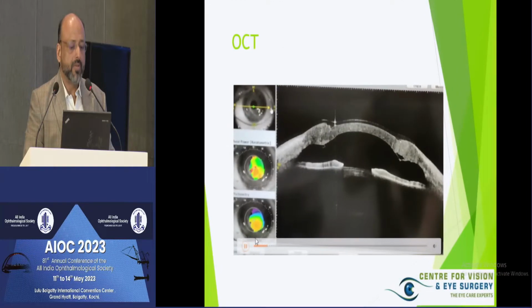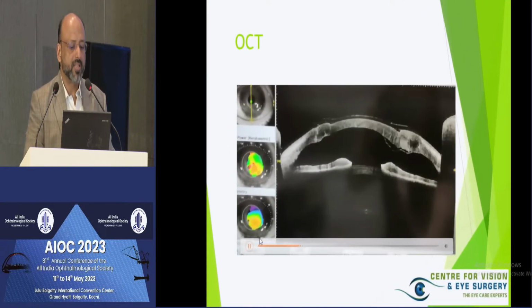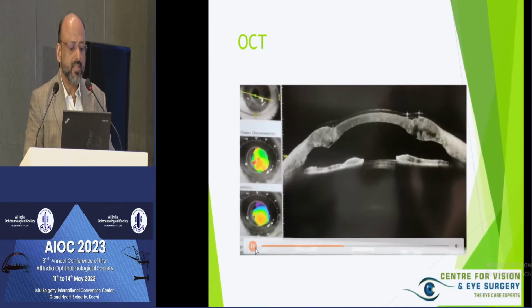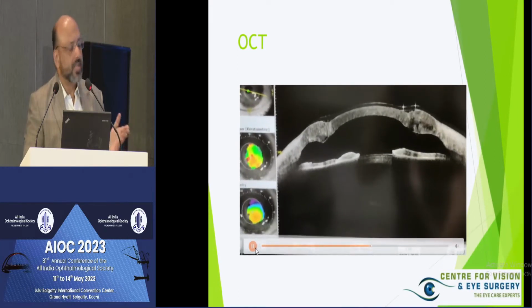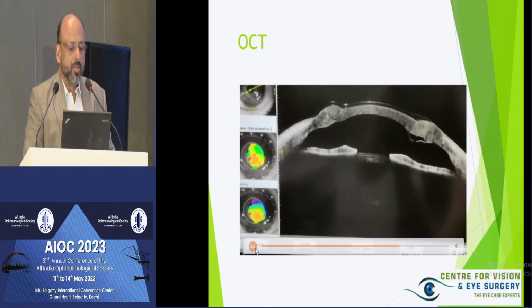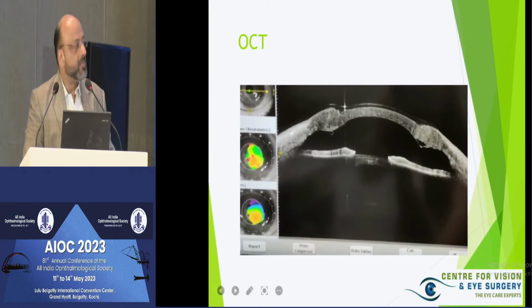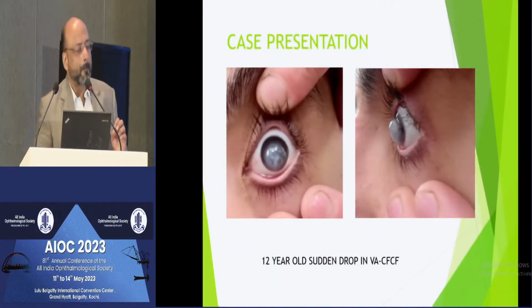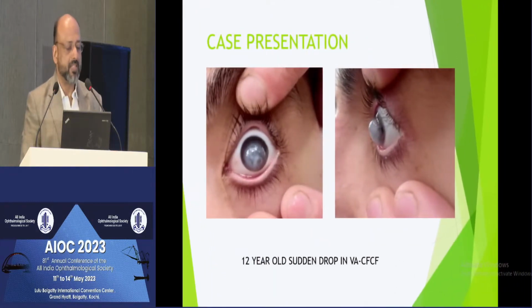And the video of the OCT shows that the area of detachment which was there is not very large, it's not extending, it is continuous. So we decided to just observe. So the corollary is that the amount of Descemet's detachment makes a difference.